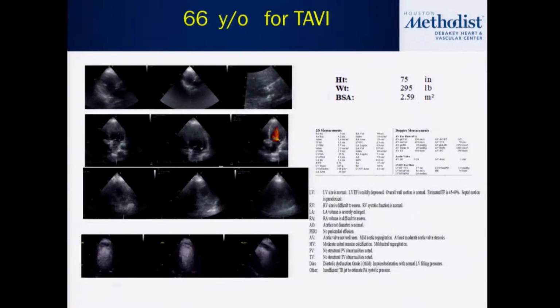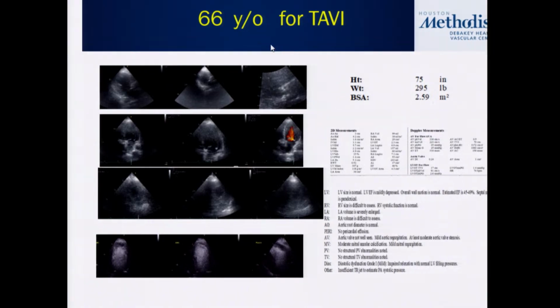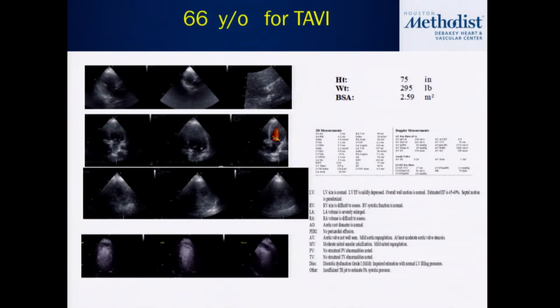All right, moving on, CT, okay? Why do we even want to do CT-EF, right? Well, occasionally you get a patient like this, a patient with TAVR, and you can see with the contrast, EF is maybe mildly depressed.